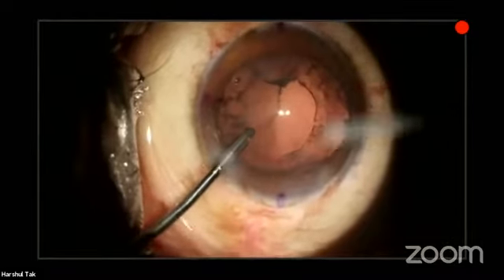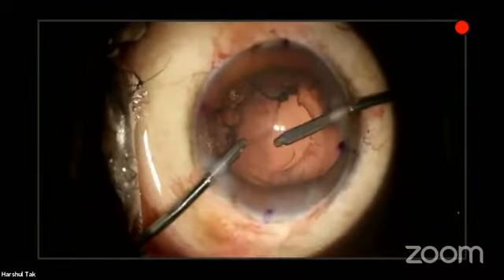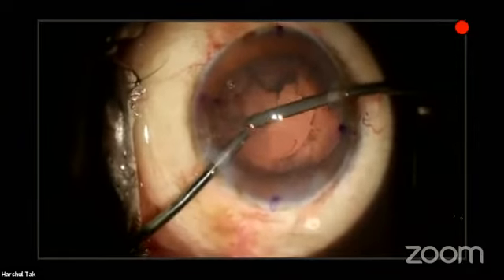So bimanual is my preferred technique for irrigation aspiration. Dr. Mayank ne scrub kiya.